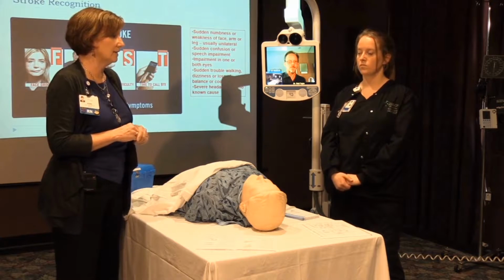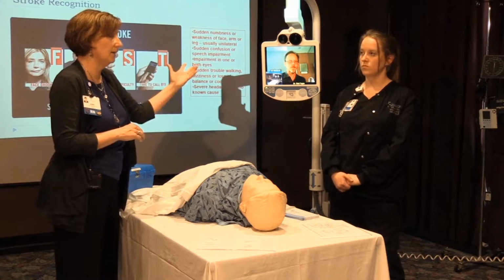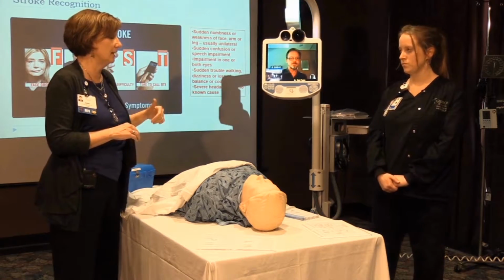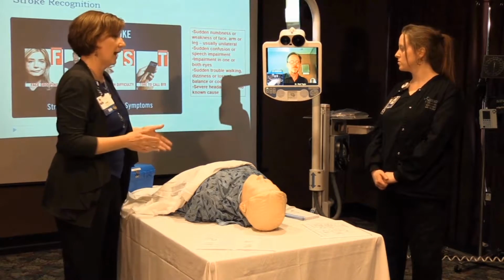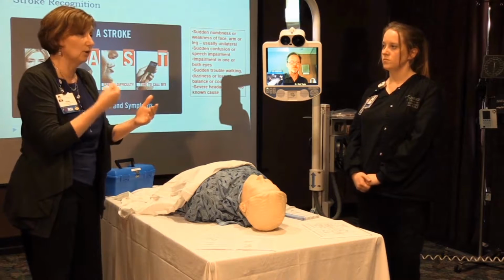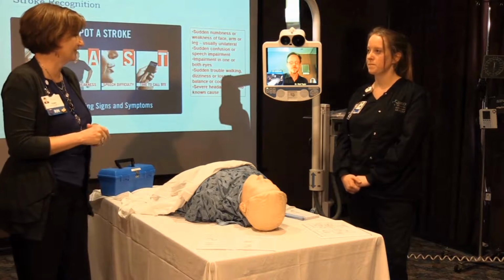A couple of other caveats is that our new cart system here, the provider is not able to drive the cart. He can actually maneuver the head, he can change the zoom on the lens, he can turn up and down the volume, but he's not able to drive the device, and so if he needs your assistance to move to the other side of the stretcher, to be able to get into a different angle towards the patient, it requires a staff member to be available for that. Plus, you want to know when the provider says, hey, it's a go, we're going to treat, then you're here ready to go ahead and mix the alteplase and begin the treatment. And now we'll go ahead and go into our scenario.